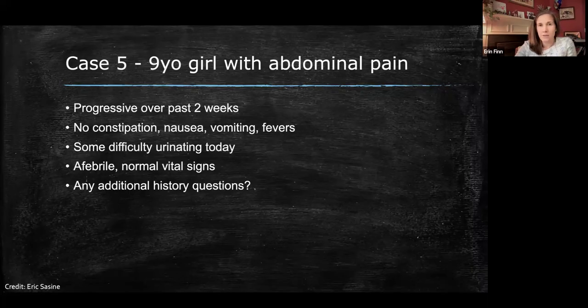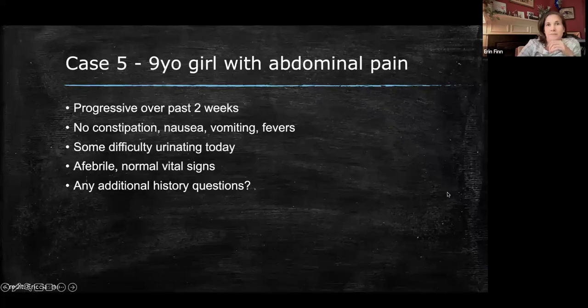So just quickly, I know this is a pretty common complaint and not very differentiated at this point, but any additional history questions or anything you all want to do first? And I'm going to move this one along a little bit by just saying so the ED POCUS, quickly just to look at the appendix.